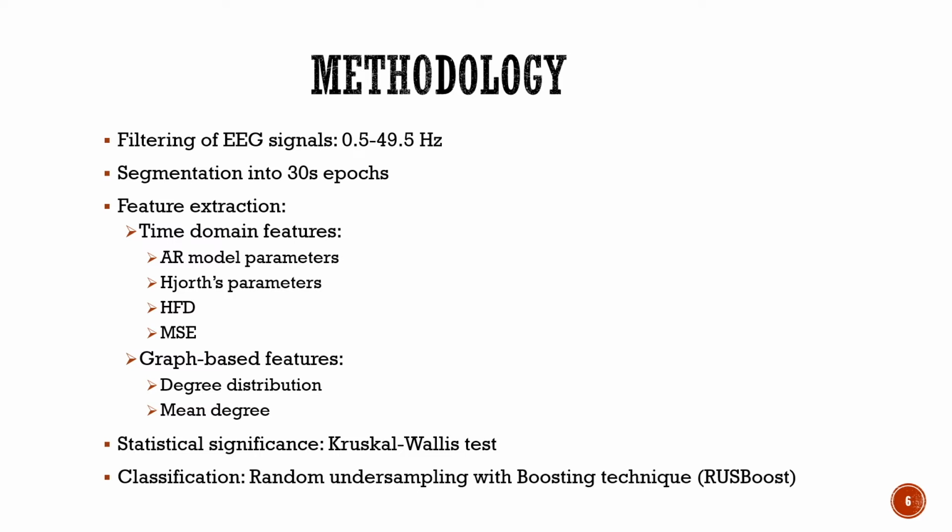Finally, we utilize Kruskal-Wallis test for statistical significance of the features, and for classification, we have used RUSBoost, which stands for Random Undersampling with Boosting Technique. And this particular classifier has been chosen because it is able to deal with the problem of class imbalance, which is very much prominent in sleep staging problems.